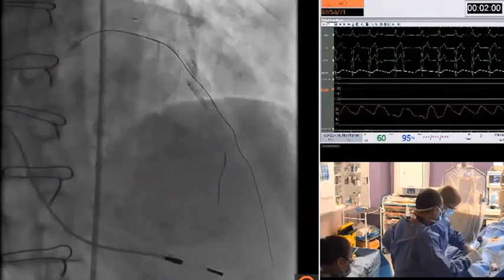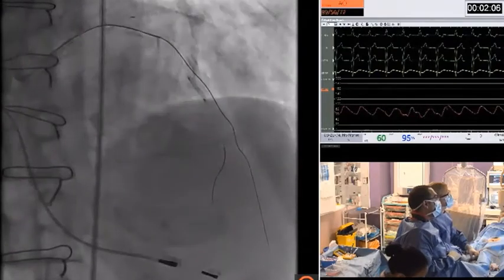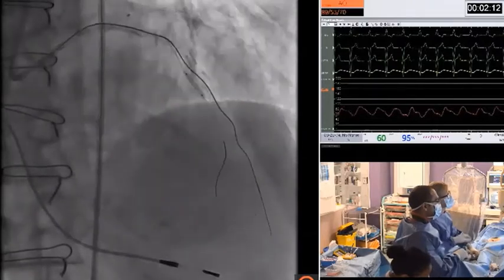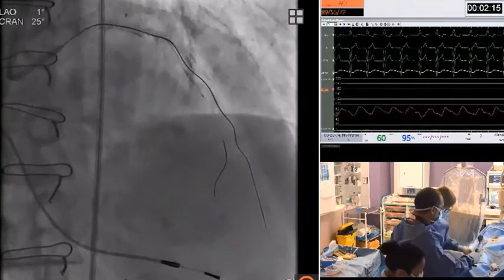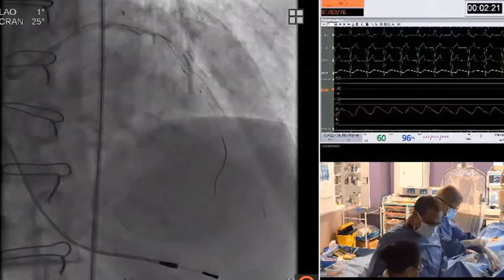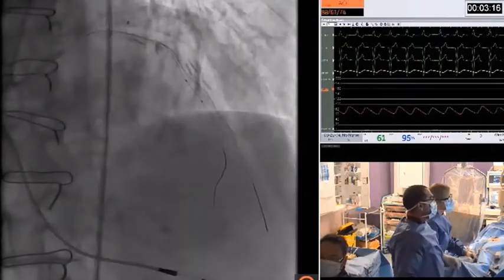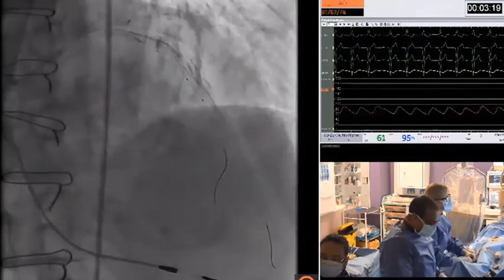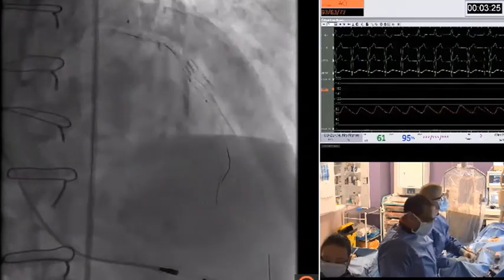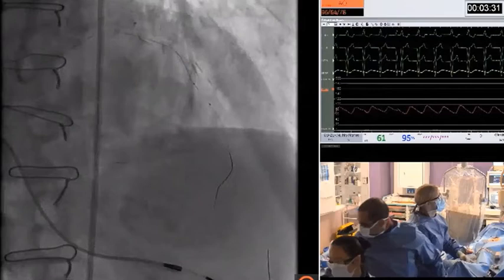So here we pass the balloon back into the septal for anchoring. And the microcatheter is then advanced easily into the distal vessel. And given the calcified nature and the inability to initially pass the microcatheter, we elected to proceed directly to rotational atherectomy. So this is a RotaWire Floppy. We use the Caravel to exchange for this.